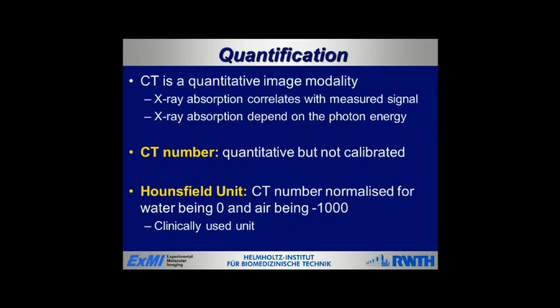Coming to the point of quantification, the good point is that we can say that micro-CT, and CT in general, is basically a quantitative imaging modality. That means that the X-ray absorption correlates with the measured signal. And the X-ray absorption, on the other hand, also depends on the photon energy. And we have two important units that you should know.